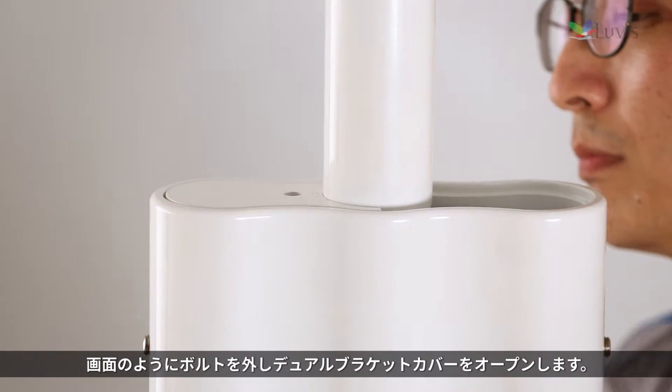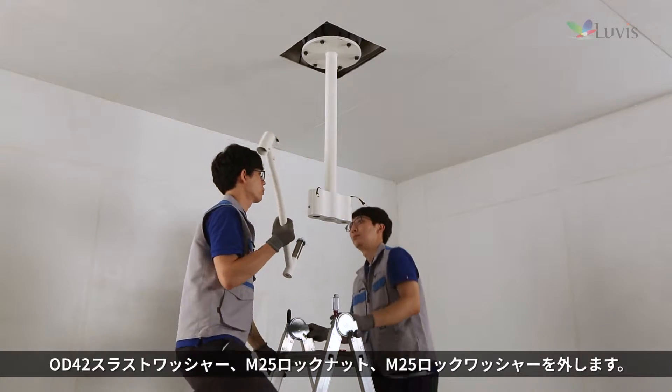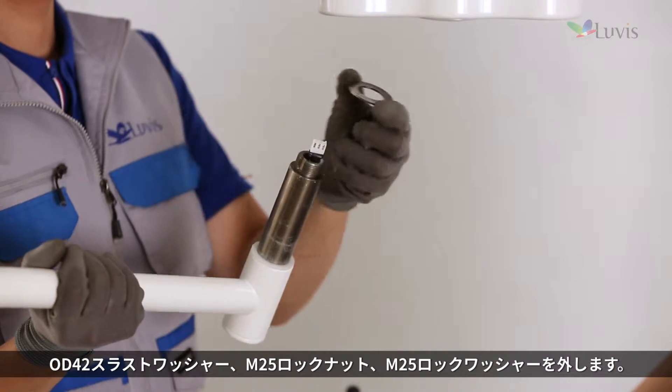Open the dual bracket cover by removing the bolt as shown on the screen. Prepare the wall second arm and disassemble the OD42 thrust washer, the M25 lock nut, and the M25 lock washer.